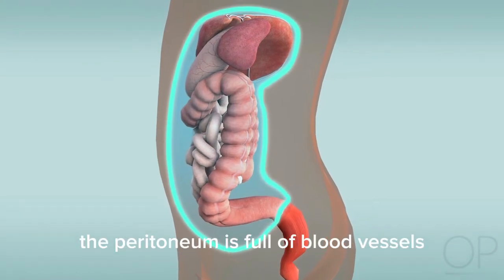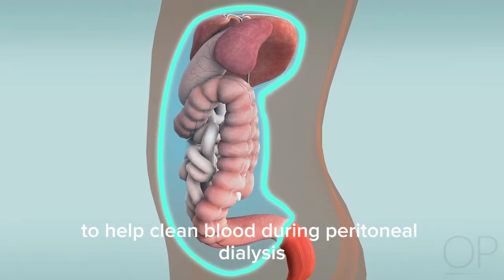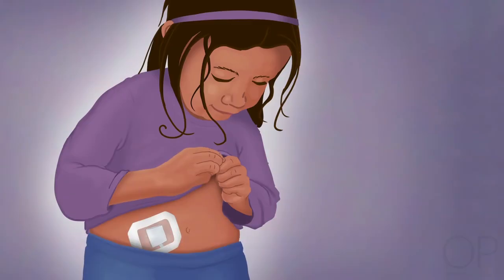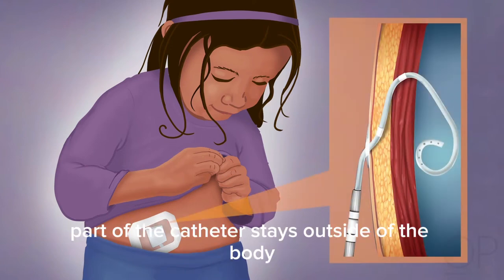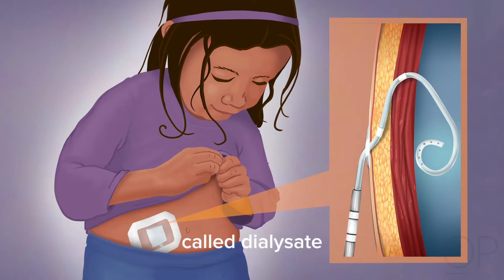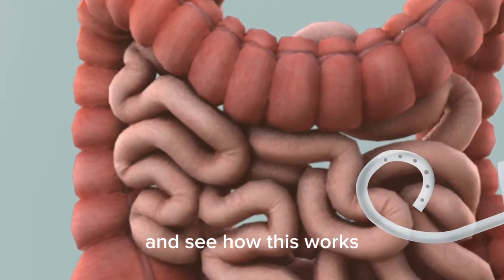The peritoneum is full of blood vessels. It acts as a filter to help clean blood during peritoneal dialysis. Before dialysis can start, a special tube called a peritoneal dialysis catheter will need to be placed inside your child's abdomen. Part of the catheter stays outside of the body, connecting to the peritoneal cavity. This allows us to pump and drain an important liquid called dialysate into your child's abdomen. Let's travel into your child's peritoneal cavity and see how this works.